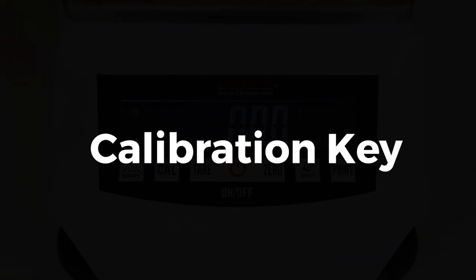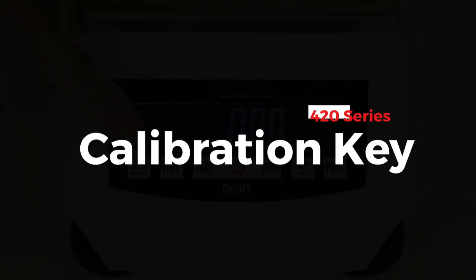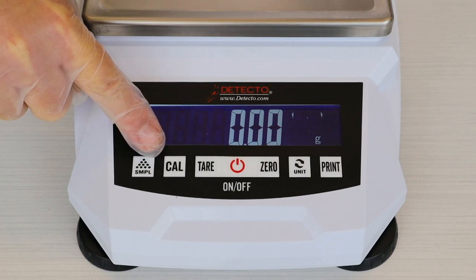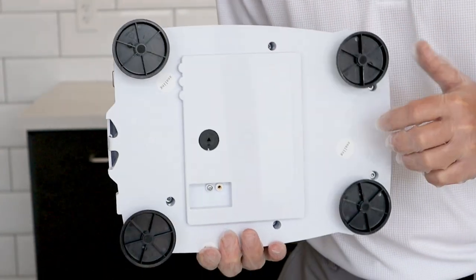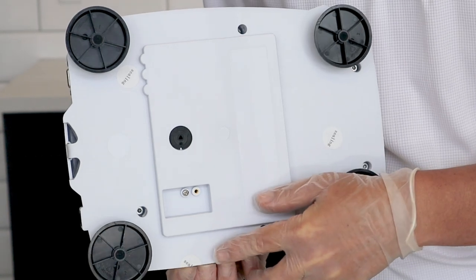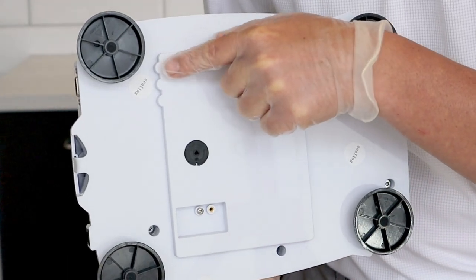The CAL button is used when you want to calibrate the scale. If you need to recalibrate the scale after its initial calibration, which is done prior to shipment from the factory, be sure to enable the calibration switch located on the bottom of the scale before pressing the CAL button on the keypad. Note that this switch will be sealed during legal-for-trade applications.